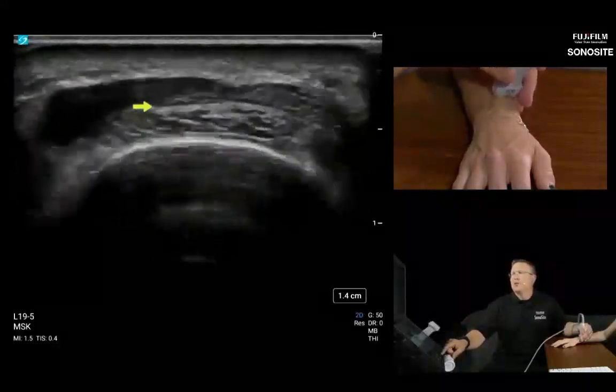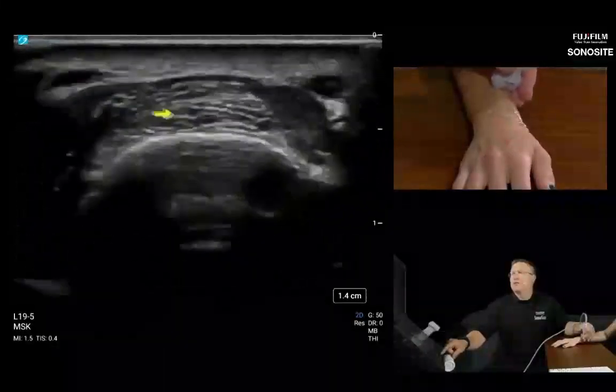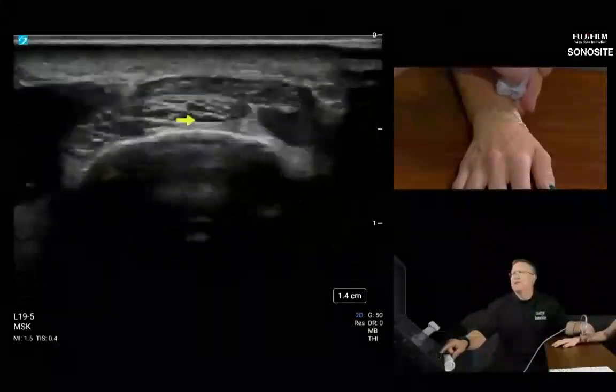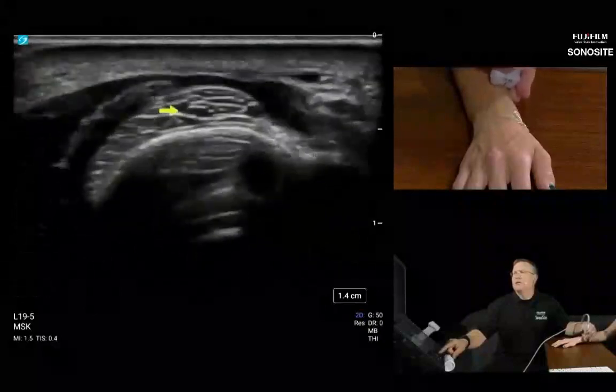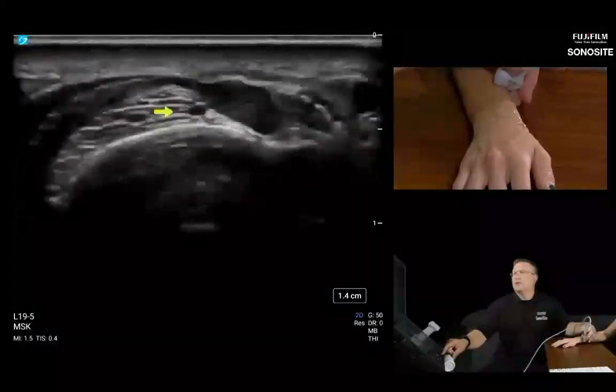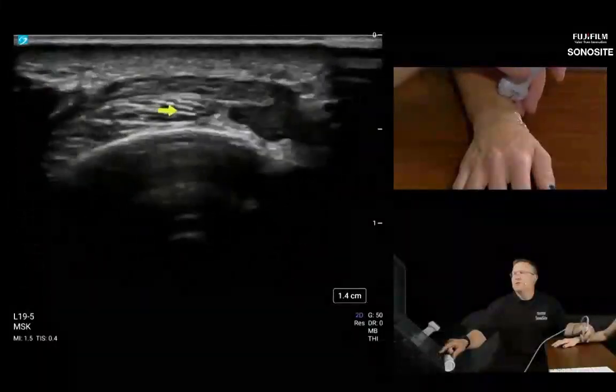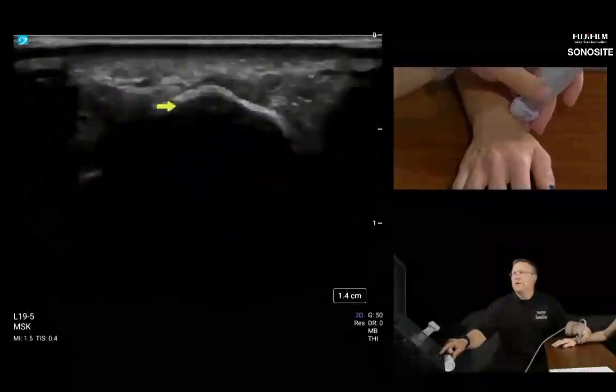More important proximally for intersection syndrome, there you can see the two grinding on each other. No pathology today, it's just how it goes. Something to keep an eye out on. Right there I'm just panning proximal to distal to show the relationship and how close they come. I'm going to go distally.